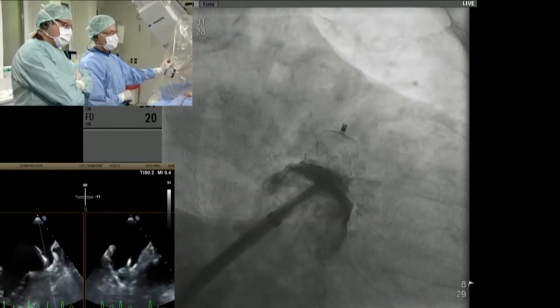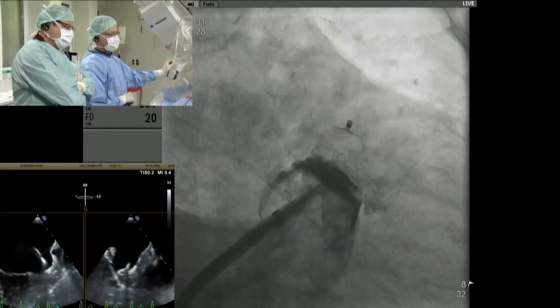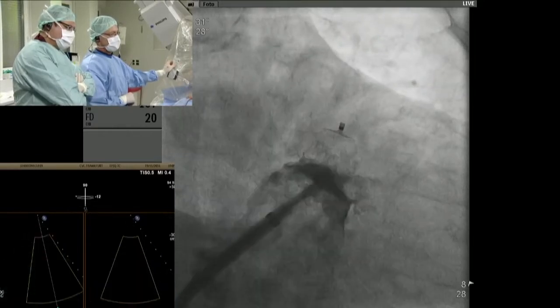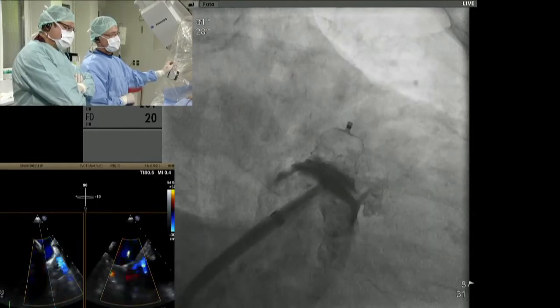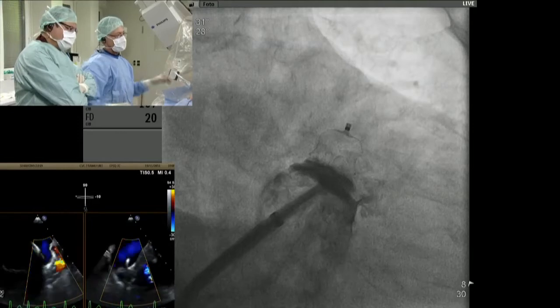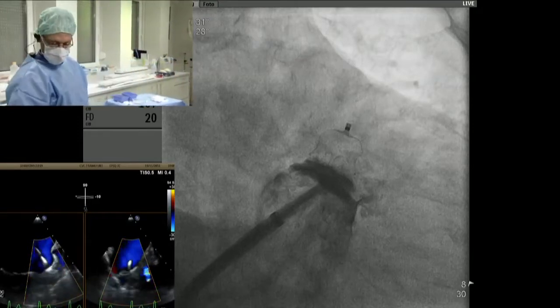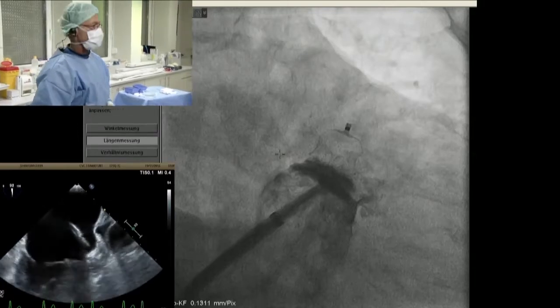Well, it sounds like from this experiment, what was mentioned earlier with the Lifetech, the special device with the bigger disc, is exactly what you need. What this seems to be, because it's a small ball and the big umbrella. Yeah, it would be worth measuring the lobe there just to see, because that's the true stretch diameter. And it's expanding, actually. Yeah, you can measure right there, and probably that's the device that would work. It's wider now than when it first went in.